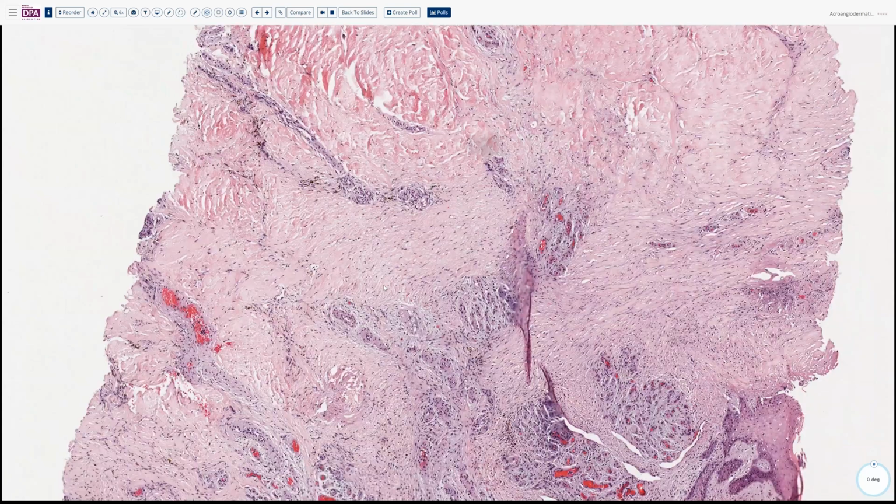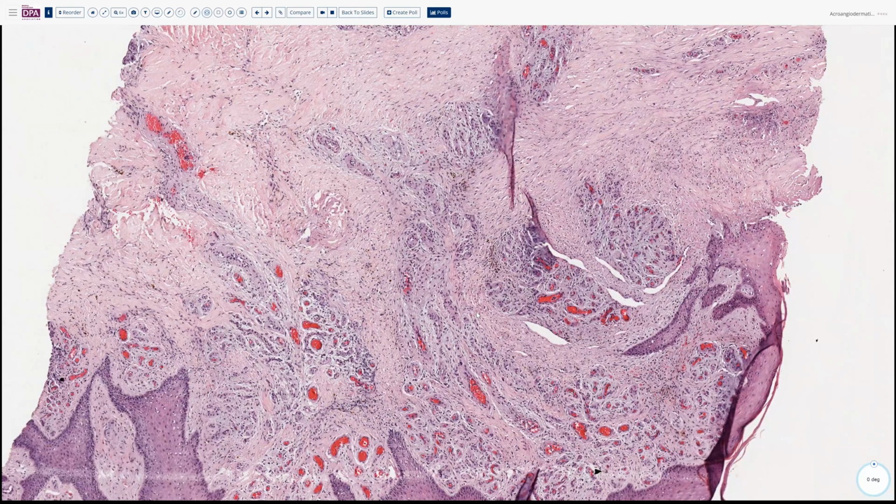So either way, I think just giving it that diagnosis of acroangiodermatitis is the appropriate thing in the right setting. So not every stasis dermatitis is going to be this, but certainly given the type of changes we're seeing here with lobularity, hemosiderin deposition, and the associated thick-walled capillaries, fibrosis, and so forth, you should be thinking of acroangiodermatitis.